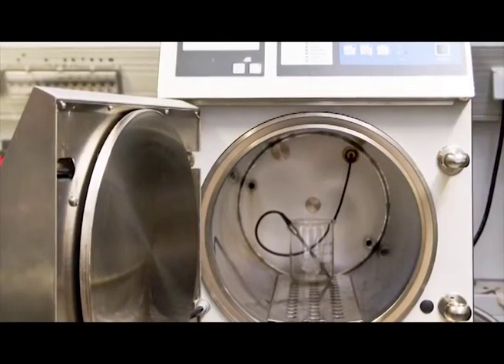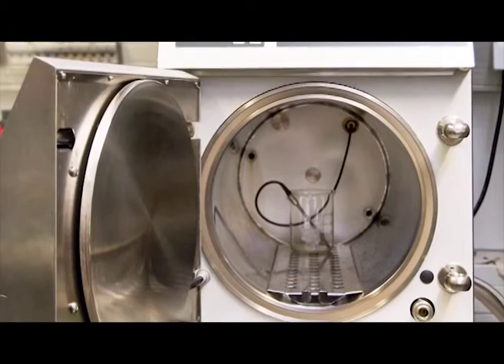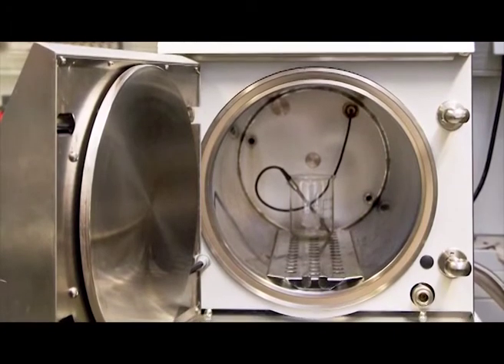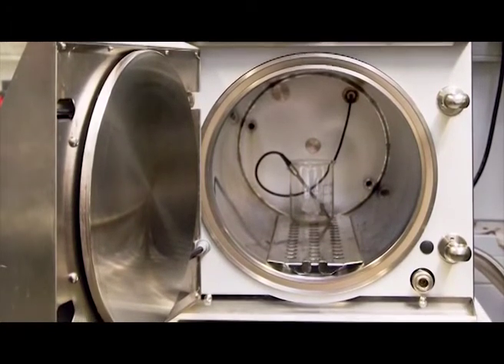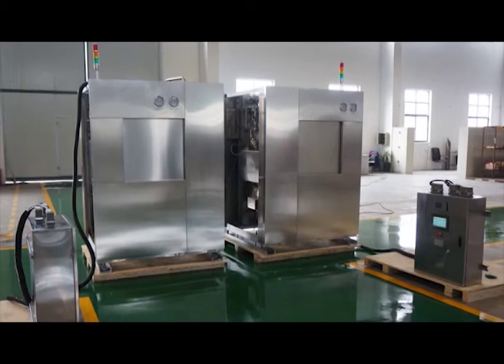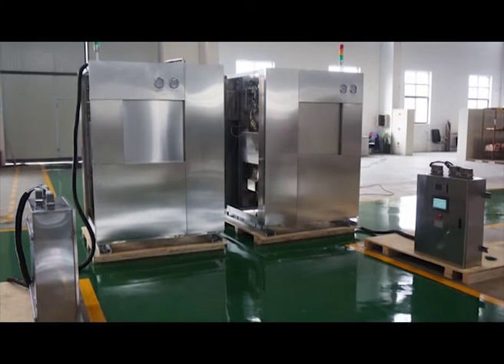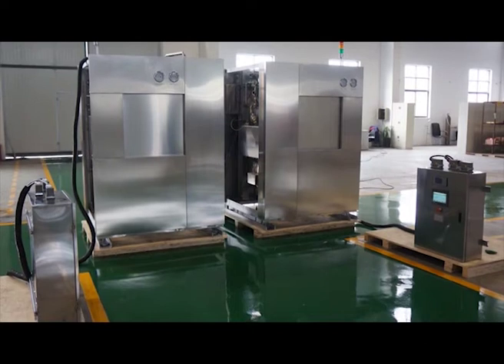There are various types of methods used for sterilization, and according to the utility of those methods, the equipments are designed. The method to be adopted will be decided according to the nature of material to be sterilized. The sterilizer has to be designed, manufactured and validated as per ISO 11135:2007.